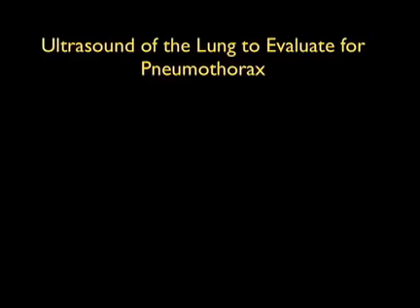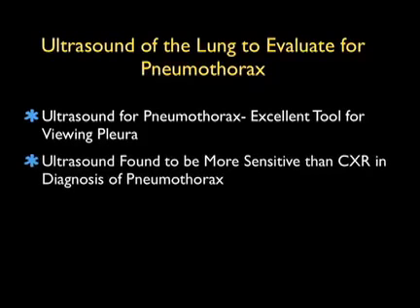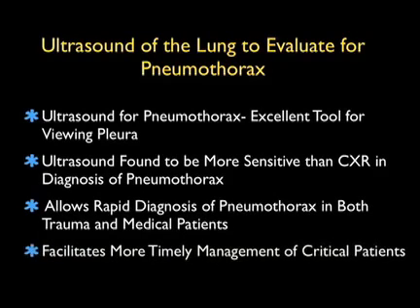In conclusion, I'm glad I could share with you this ultrasound module going over ultrasound of the lung to evaluate for pneumothorax. This is an excellent tool for viewing the pleura and making the diagnosis of pneumothorax, and there's been some research showing that it may be more sensitive than chest x-ray in the diagnosis of pneumothorax, allowing rapid diagnosis of pneumo in both your trauma and medical patient, thus facilitating more timely management of these most critical patients.